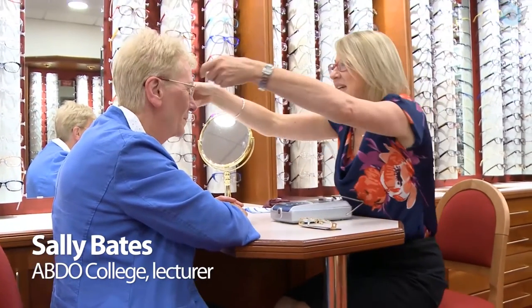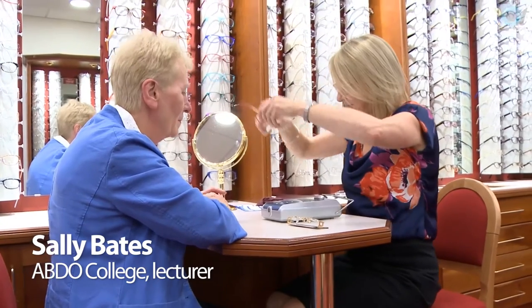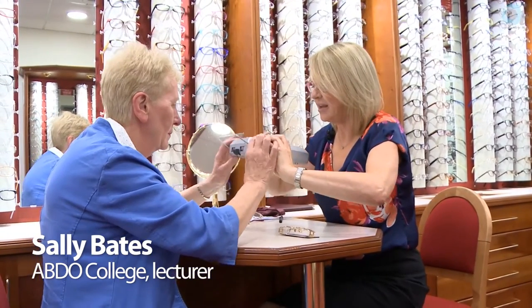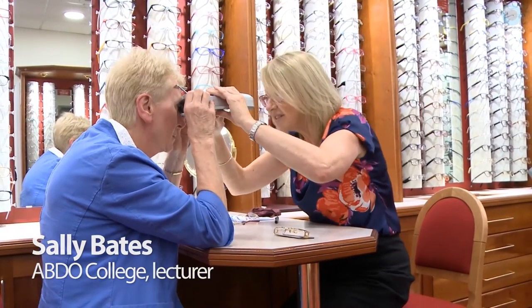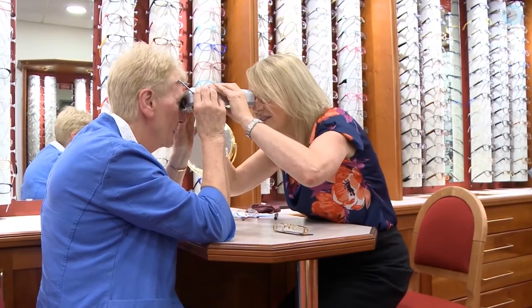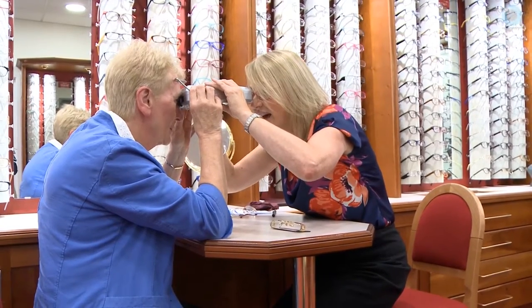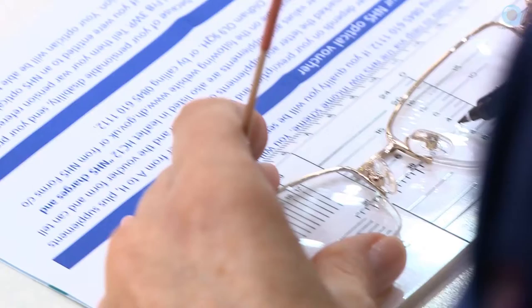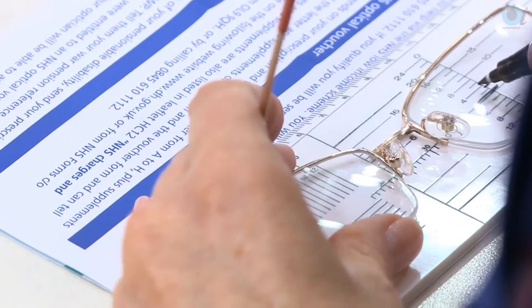We need to take some measurements for your new spectacles, so if we take those off for a moment. What I need you to do is hold this up like a pair of binoculars and look down there for me. That's it. Good — if you look at the light, that's fine. Great, thank you, and we'll measure you for your new pair.